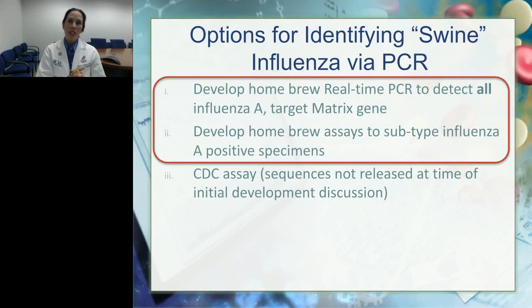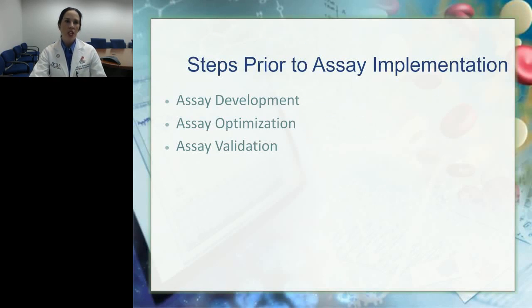So at that point in time, rather than wait, we decided to go forward with our development of a homebrew assay. So what do you have to do to bring an assay like that up? Well, assay development, assay optimization, and validation. Sounds easy, 1, 2, 3, but it's not quite as straightforward as it sounds.